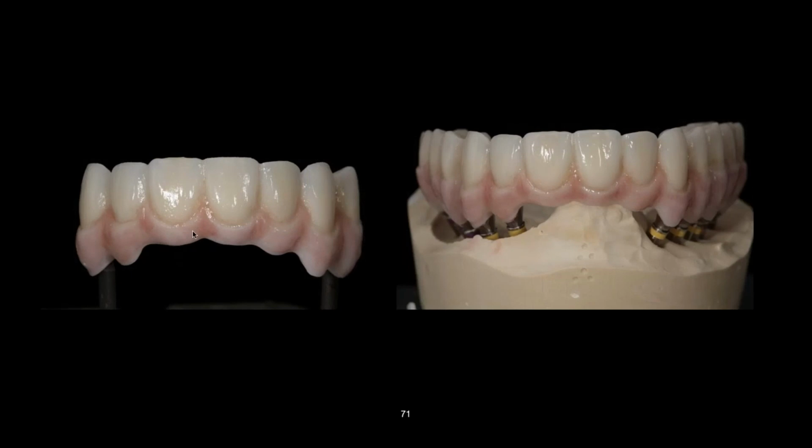And this is the anterior segment. These are glazed. And then I polish them a little bit more. When it's an older patient that are cancer patients, they can't clean very well. A lot of times you need to fill this in a little bit. Doesn't make it as good looking, but you can rinse everything out with a water pick. Some of these people are really compromised.